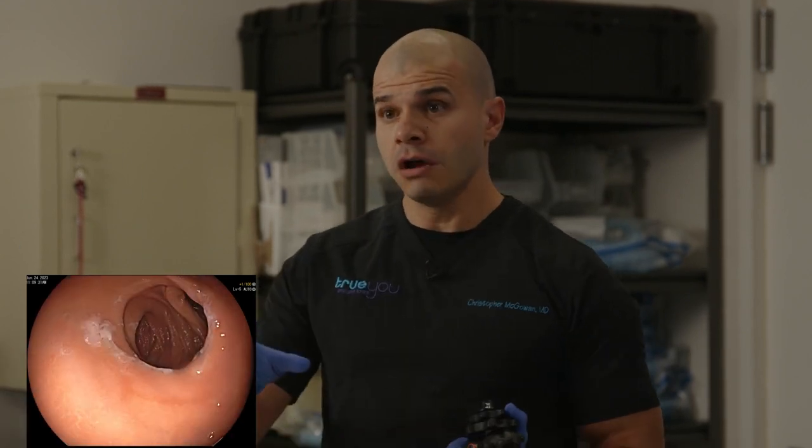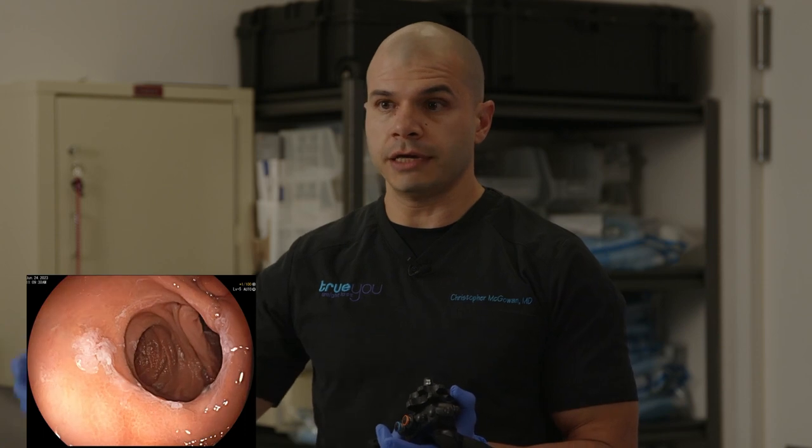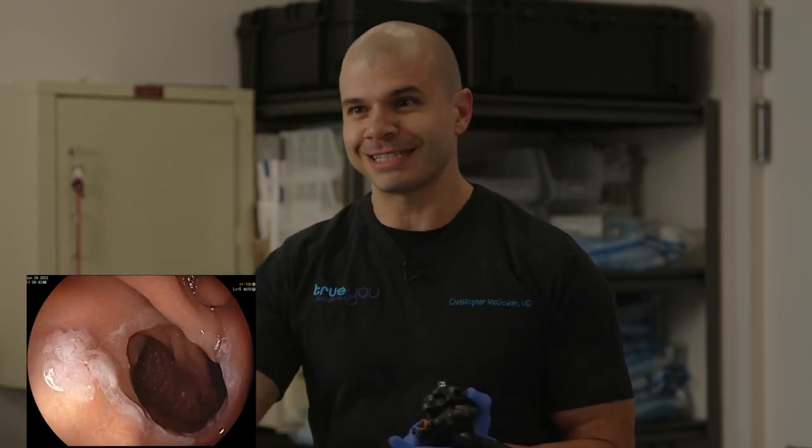And so our patient reported less of a sense of restriction, less fullness, less satiation with meals, and that can lead to weight regain. In fact, we know from studies more than 10 years ago that the size of this outlet directly correlates with weight regain. And so in this case, this has dilated over time, and we're going to address that right now. So this is the gastric pouch. This is the anastomosis, or what we call the outlet. And we're performing a transoral outlet reduction. We are going to reduce the outlet via the mouth.